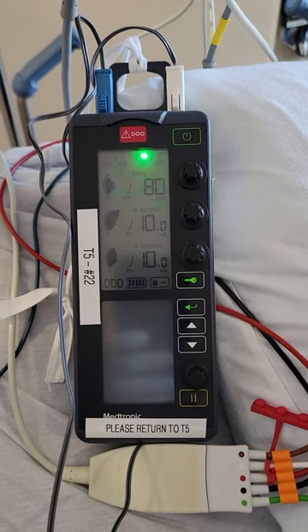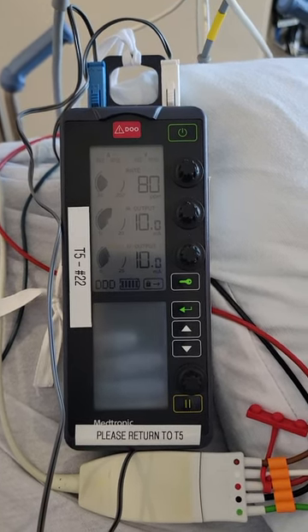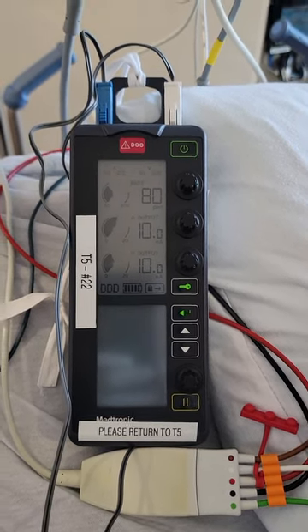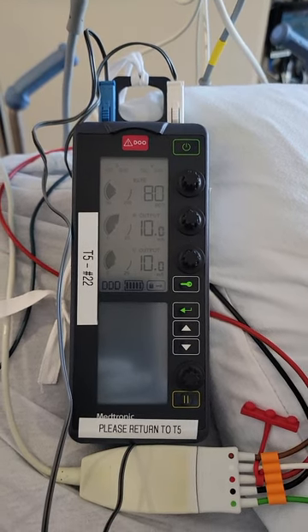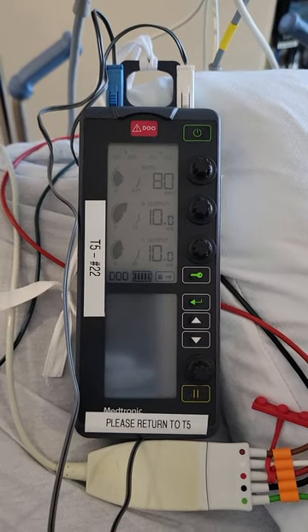This video is on temporary pacemaking. We're going to go over the epicardial pacemaker — these are the settings that are usually on the pacemaker right when the patient gets back. This is an open-heart patient. We can use this temporary pacemaker on other patients as well that maybe have a transvenous pacemaker, but I'm going to show you what exactly you're going to look for and what you're going to do with an epicardial pacemaker.